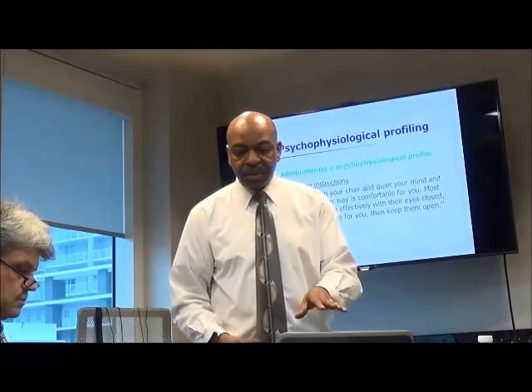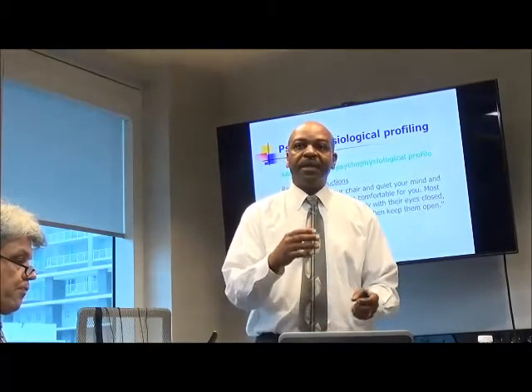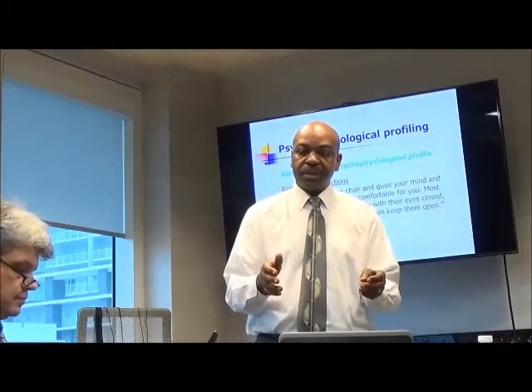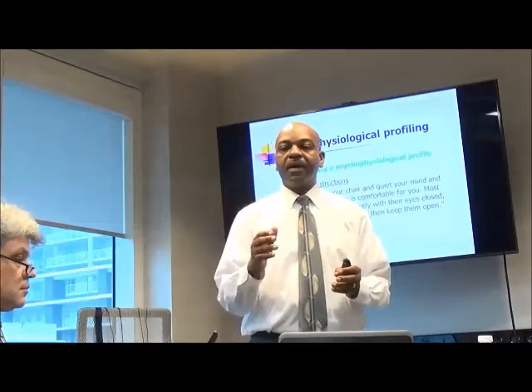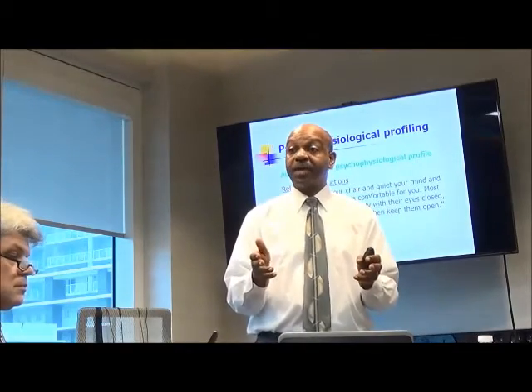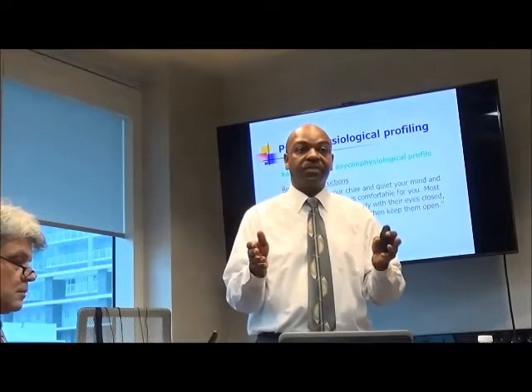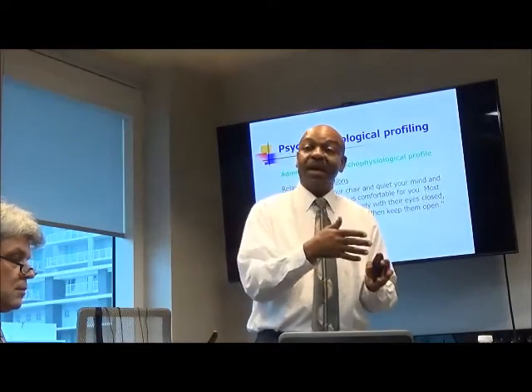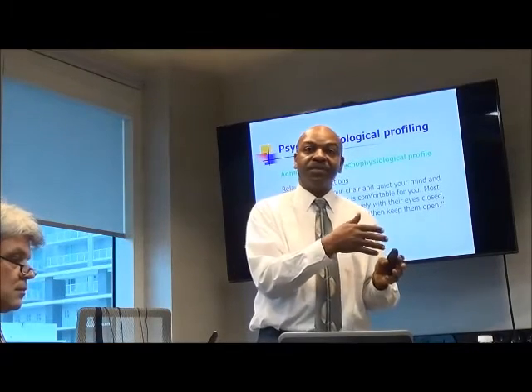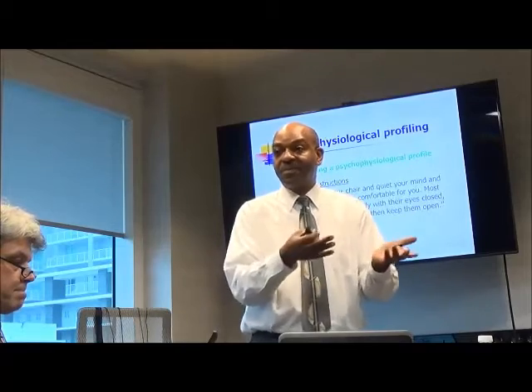In the software that I tend to use, the Thought Technology software, the stress assessment that's pre-programmed has a task that is like a Stroop test. For that task, it's presented on the screen, but the physiological measures are not presented on the screen. So it's okay for them to watch the screen during that time. In fact, they have to do the task.